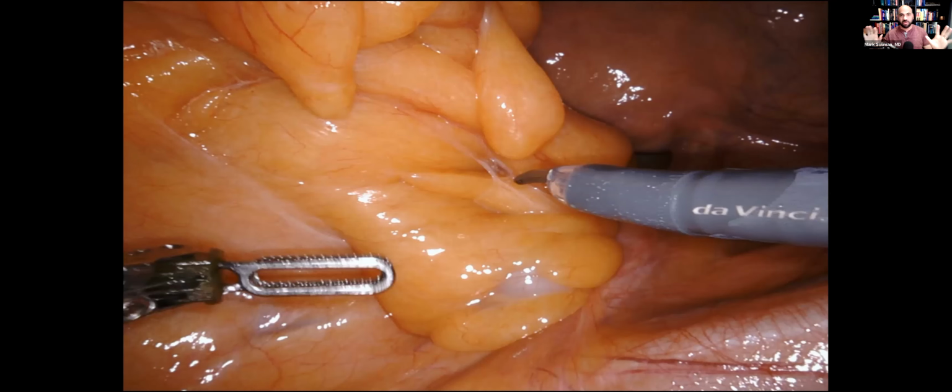Look, you have a robot with 4 arms on it. You have an assist that can assist you. Take down the adhesions such that the anatomy that you're dissecting and everything that you're doing is reproducible every single time. And that way you're not relying on the adhesions being in the exact perfect spot each time. I can count on maybe one finger how often an adhesion has actually helped me with retraction in a robotic operation. Laparoscopy I get because you need that help sometimes.